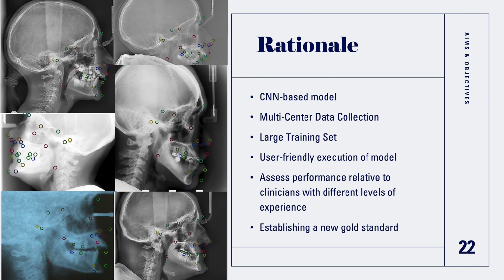Our model's performance will be compared to orthodontic residents with varying levels of experience, practicing clinicians who have completed residency, and our expert-trained annotator to see how the algorithm ranks and if it could be a useful tool for educational settings, clinical practice, and research applications.